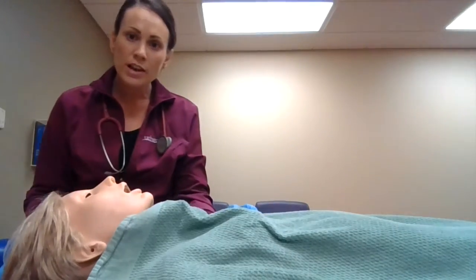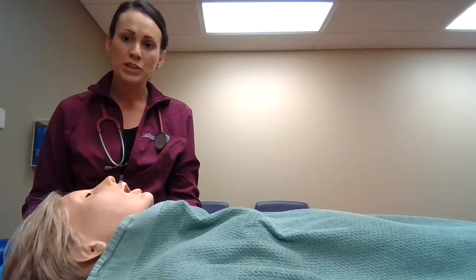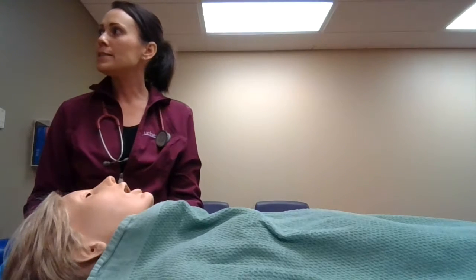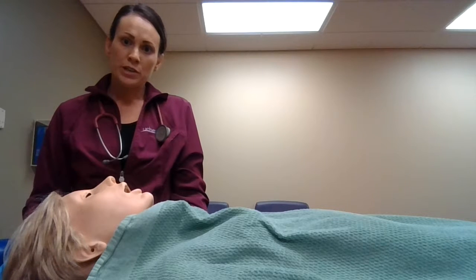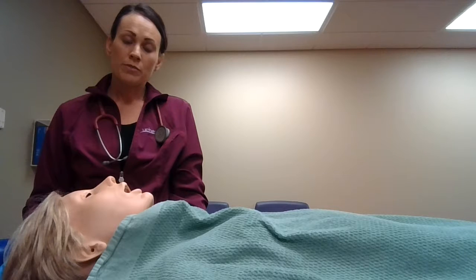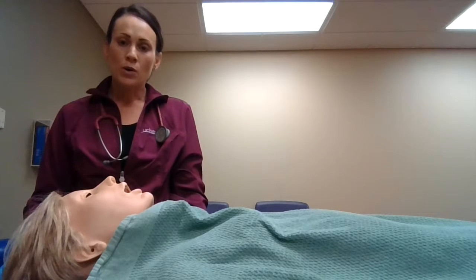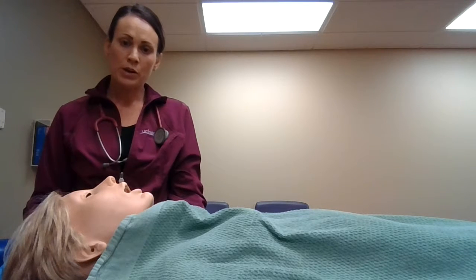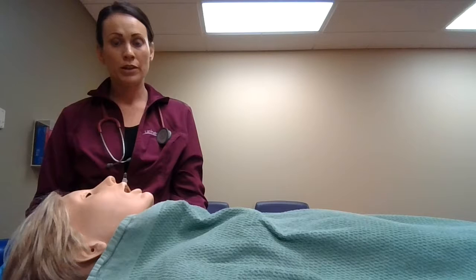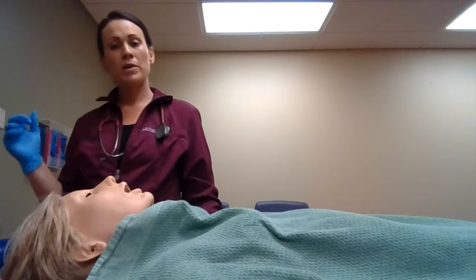I just got a phone call that I need to head over to the ER. There's a patient, a full trauma that has possible spinal cord injuries, and that I'll need to manually ventilate Mrs. Smith. So the ED has Ambu bags in there. I'm going to go ahead and grab some oral pharyngeal airways on my way.